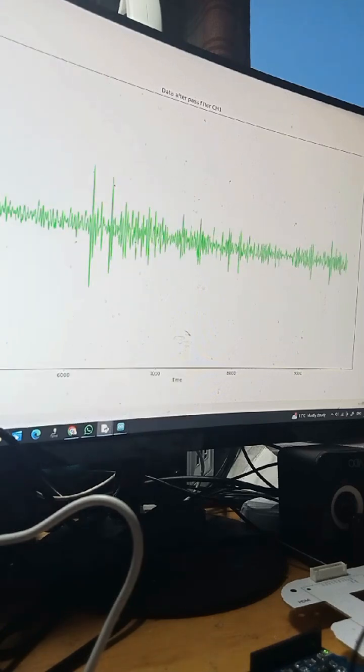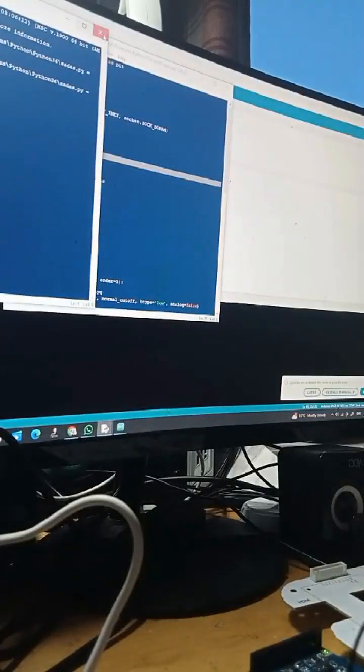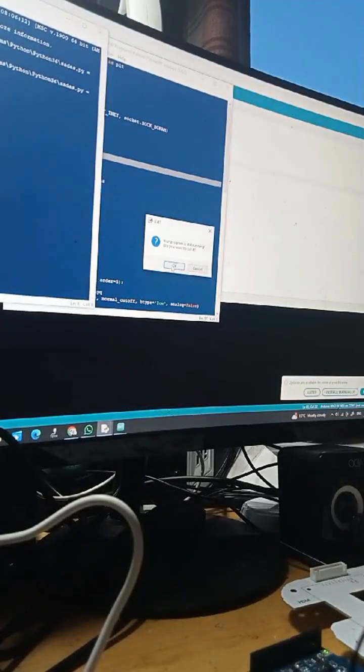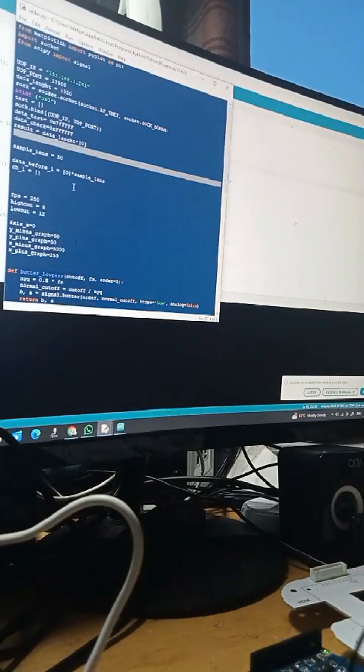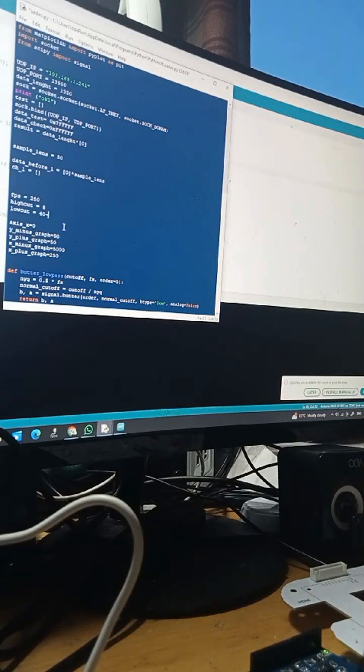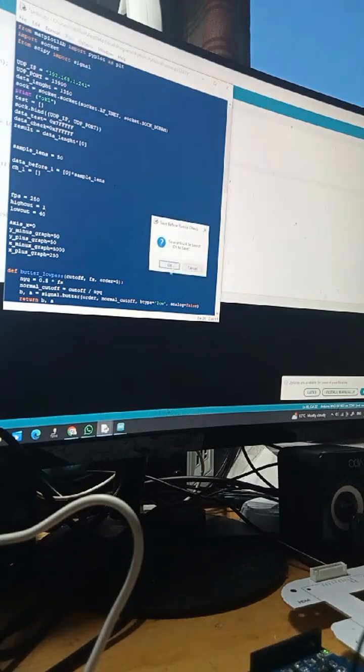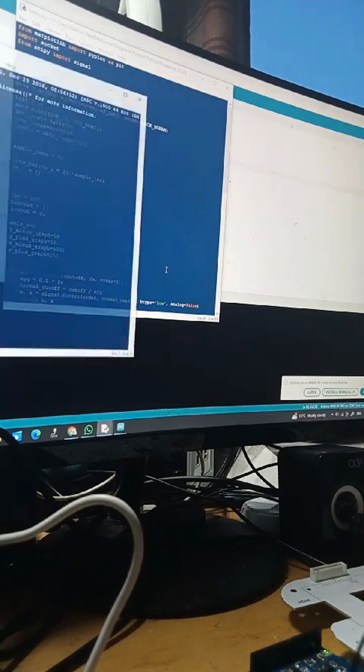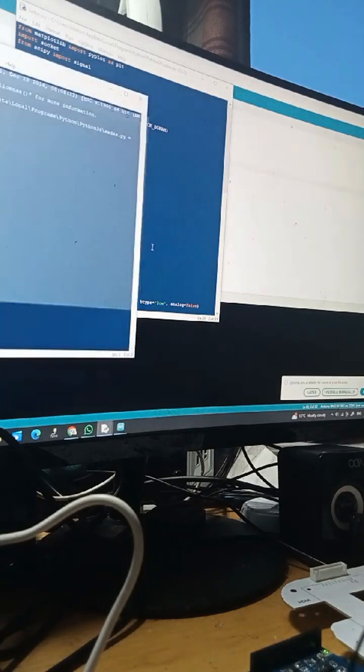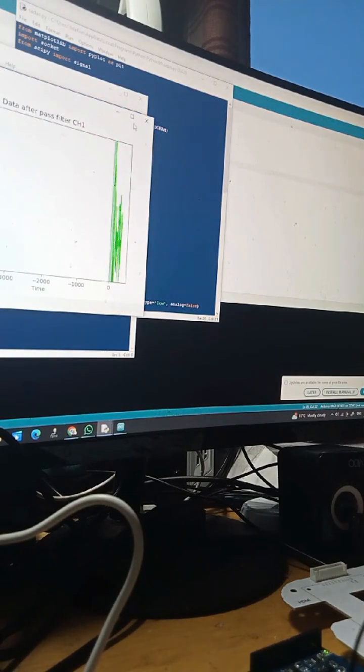And now just let me demonstrate chewing and moving artifacts. It's very easy to change bandpass filters and any other characteristics because it's Python and Arduino IDE. It can be very easy to adjust this script for any custom script.